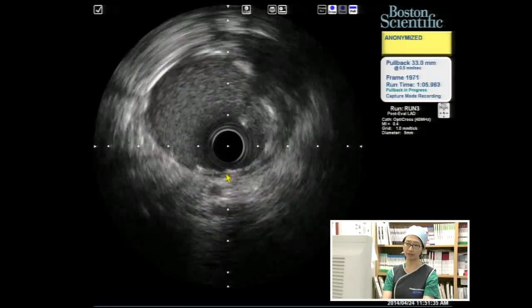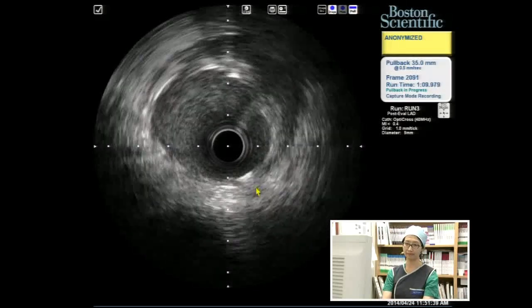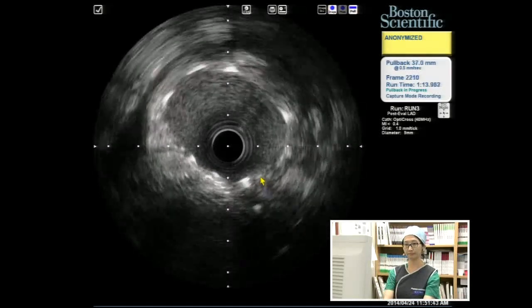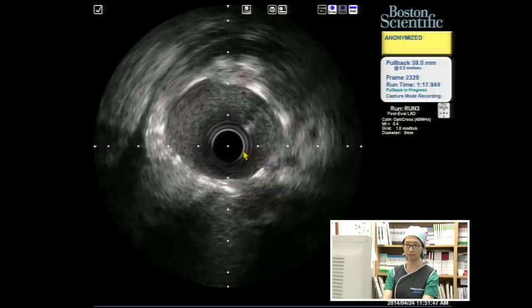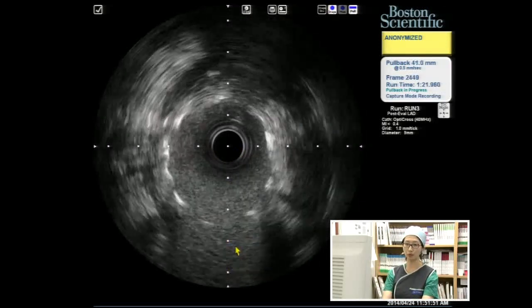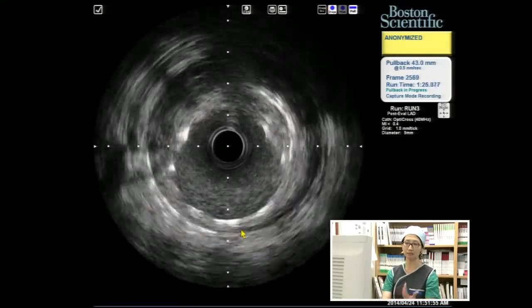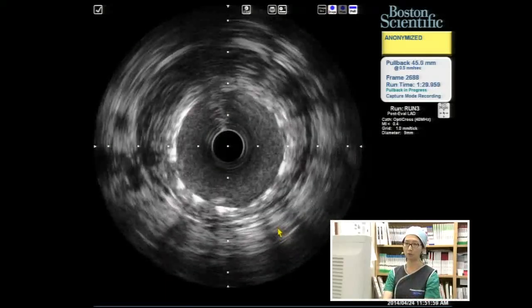And we will check that. Quite big. So far looks pretty good. Maybe a little underdone. Yes, it may be the LAD ostium. It's obviously more than 6. Then you can see some stent struts here, opening side, so it makes some artifact, but the circumflex is normal.